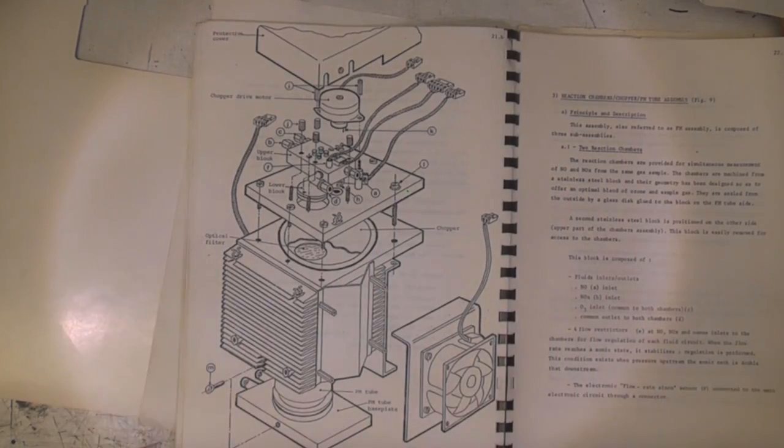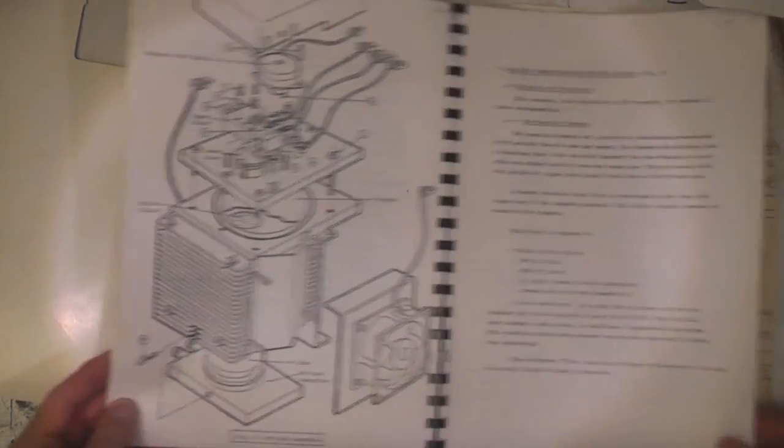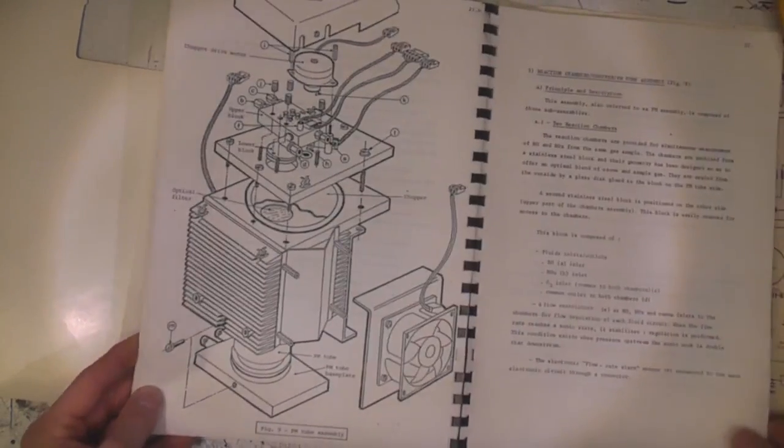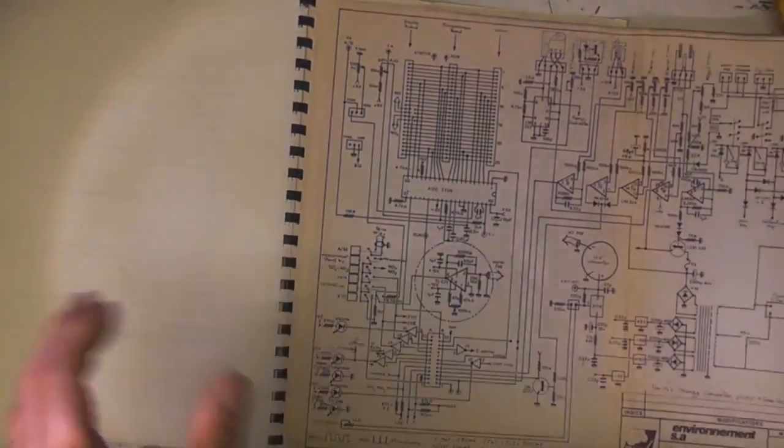There are a few alternatives like electron multiplying CCDs and avalanche photodiodes, but photomultipliers are still actually quite common for very high sensitivity light sensing. And we've got this nice schematic of the electronics as well.